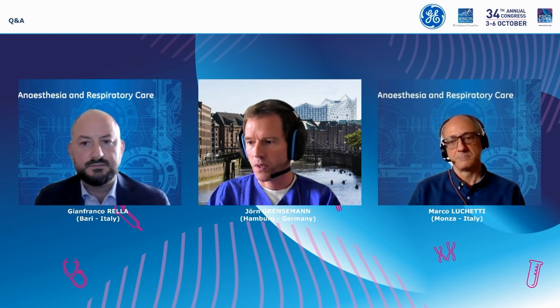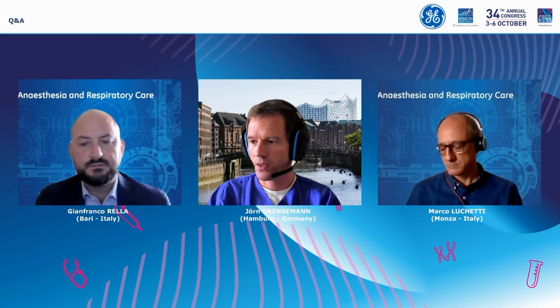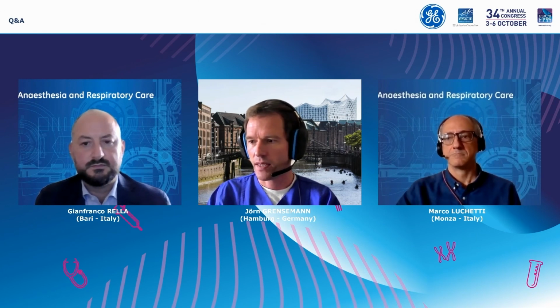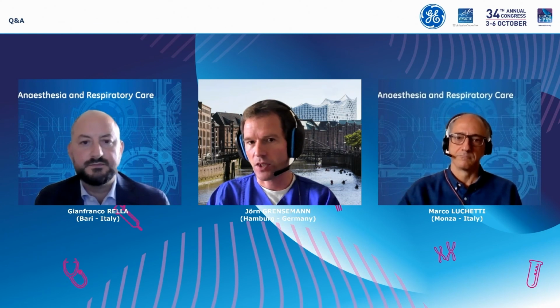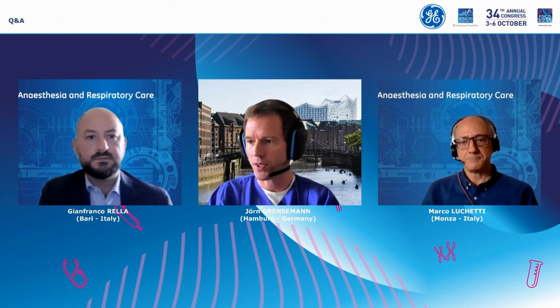So we don't have sufficient data to estimate this, and so besides septic patients, obese patients, burn patients are maybe the three categories you would usually think about, but we know that even other patients have altered energy expenditure. So I would just recommend to measure all patients if possible.